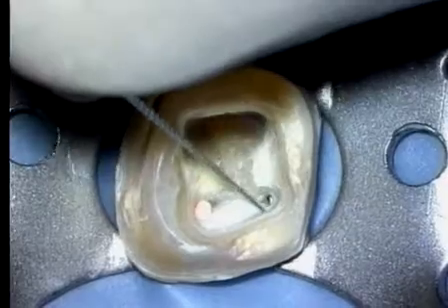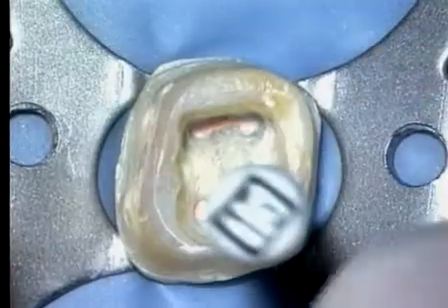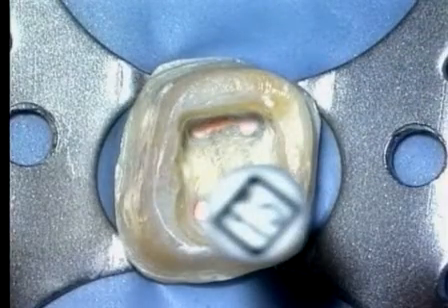Notice the distal buccal is not centered between the MB and the ML. This gives us the confidence to chase towards the distal lingual to find the missed system.